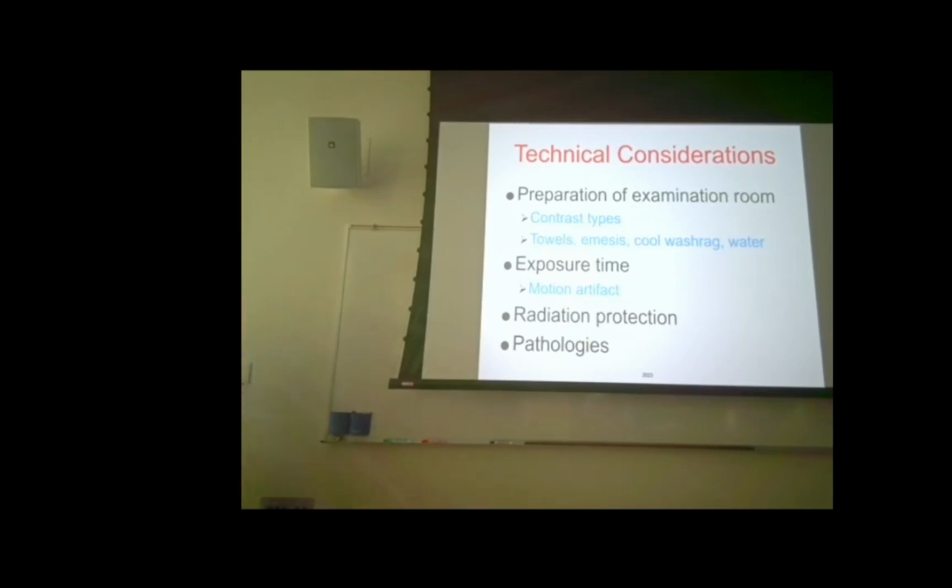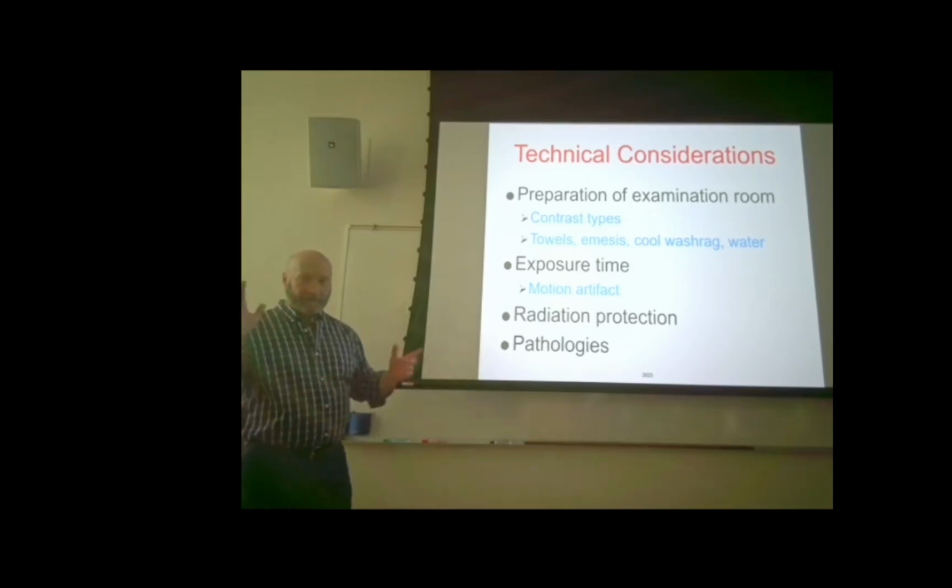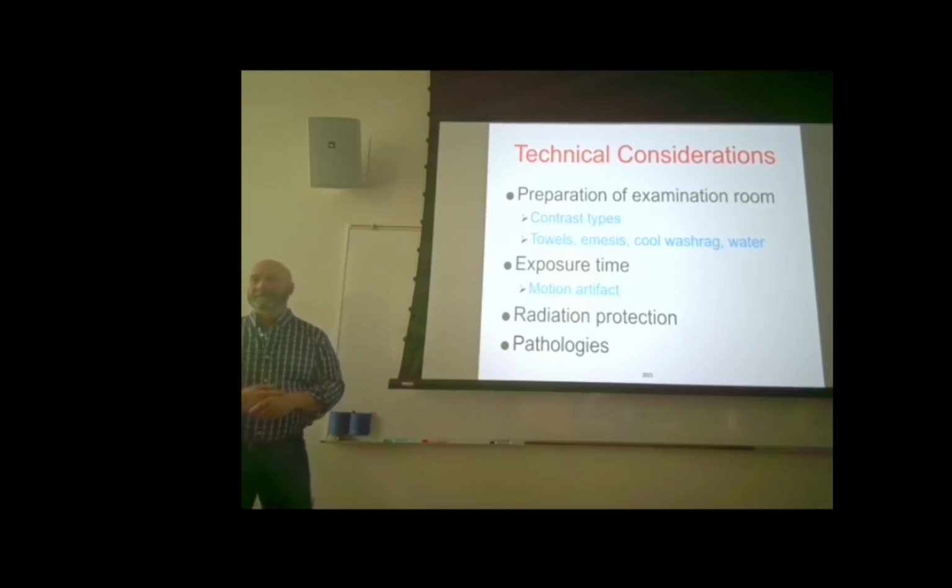All right, so preparation of the examination room. What you want to have is, predict what may happen with the patient. Anybody tasted any of the contrast? Yeah? How is it? It's not good. Not good? No? Anybody say it's good? What did you taste? Was it barium or gastrografin? Was it white, or did it look more like, I don't know, Mountain Dew? The white stuff? That's the good stuff. Ew.